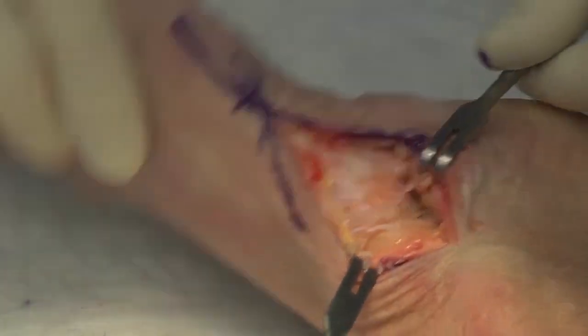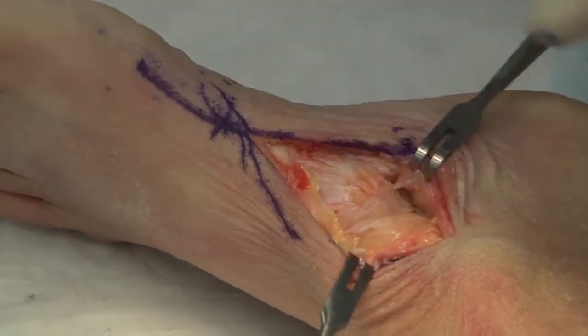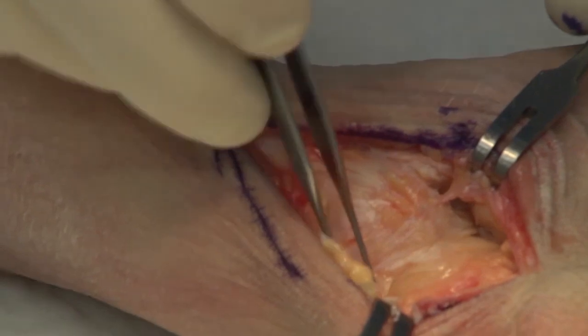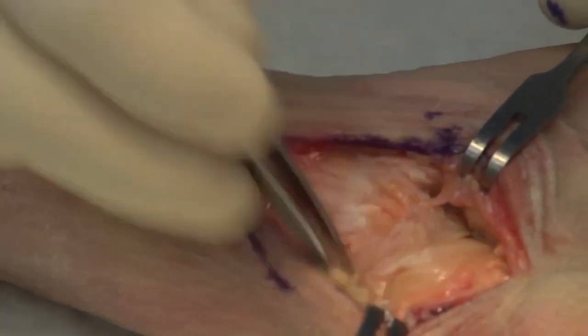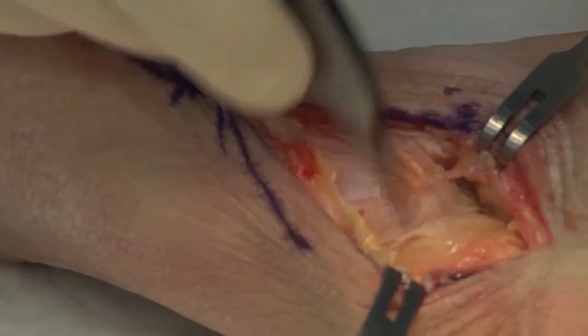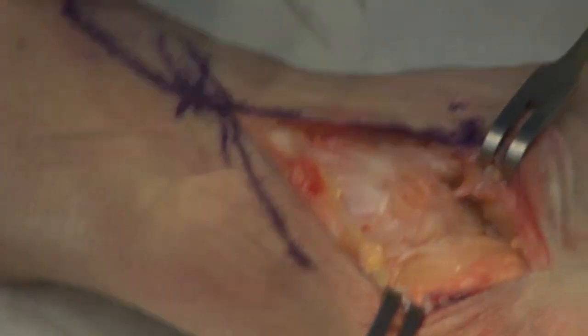So we now have the talonavicular joint — you can see the joint moving. This may be very osteophytic. There may be large dorsal osteophytes in this joint if it's an arthritic joint. Usually the osteophytes that we see with this joint, if present, are going to be on the dorsolateral side, as that is the compression side of the talonavicular joint.